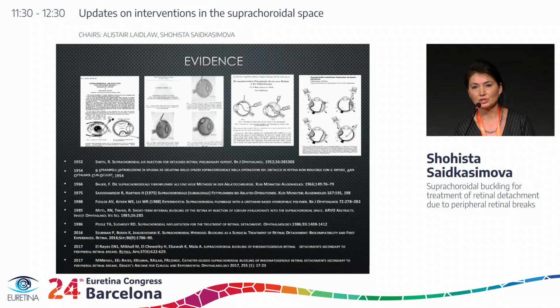In 1952, Smith from Moorfields proposed to use air injection into the suprachoroidal space and move the patient in such a way that the air will travel into the area under the break and induce the adhesion by closing the break.